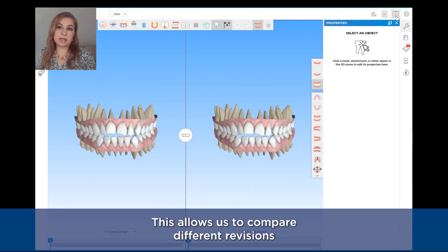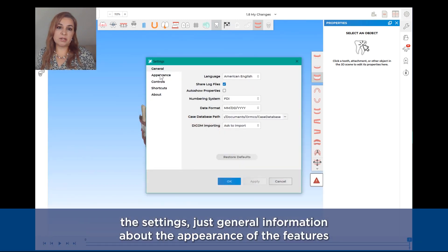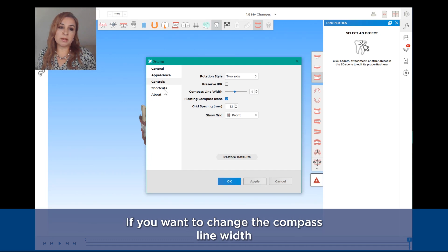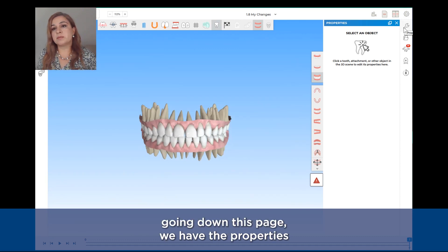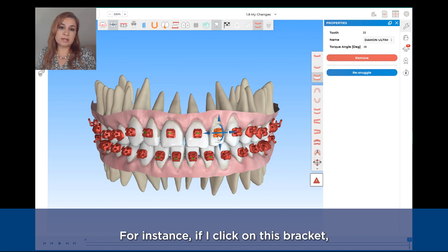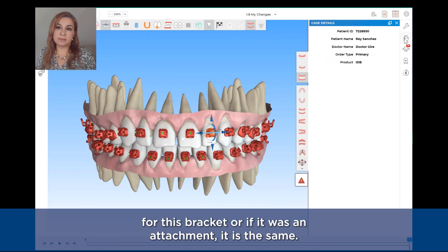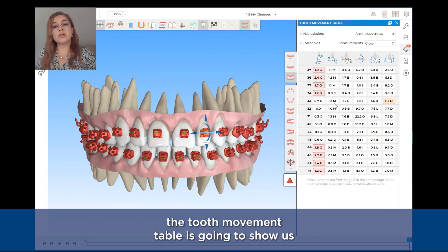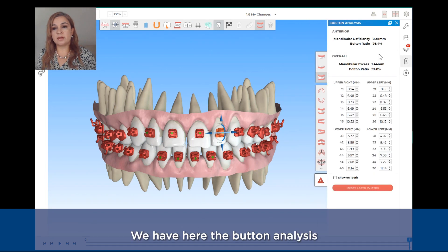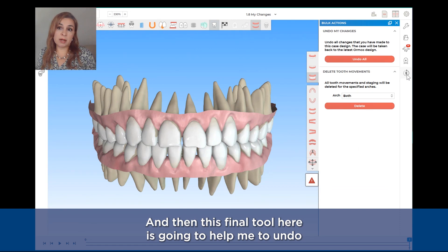Then we have the Compare Model, which allows us to compare different revisions of the case. The Settings covers general information about the appearance of features if you want to change the colors, the controls for compass line width, and some shortcuts. Going down the page we have the Properties, which will tell us the information for a feature that we click on — for instance, if I click on a bracket it will show me the properties for that bracket. We have the Case Details, the Tooth Movement Table showing movements considered more challenging versus moderate, and the Bolton Analysis to determine any tooth size discrepancy. The final tool here helps me to undo any action.